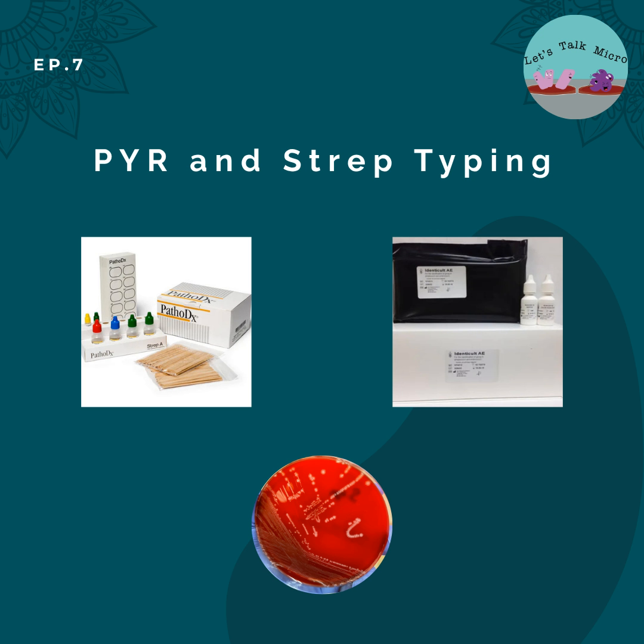So I talked about the Bacti-Staph kit by Remel, which has that same principle, but it is a very simple test. You add a drop of your latex, and then you put your colony with a stick, and then you mix, and you observe for agglutination. Staph aureus can be so strong that while you're mixing, you can start seeing the reaction. So you should see clumping with a clear background. Maybe tiny particles with a murky background is considered a negative result.